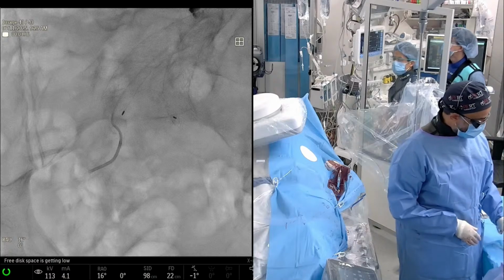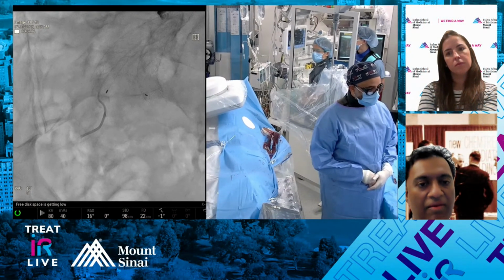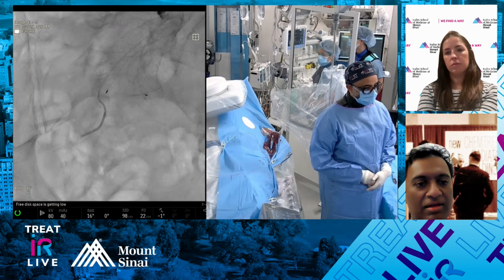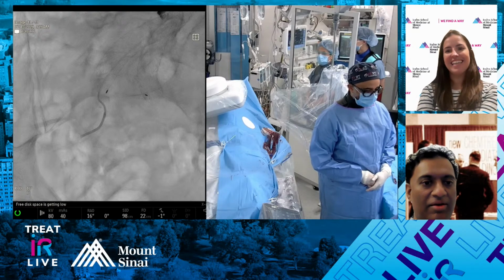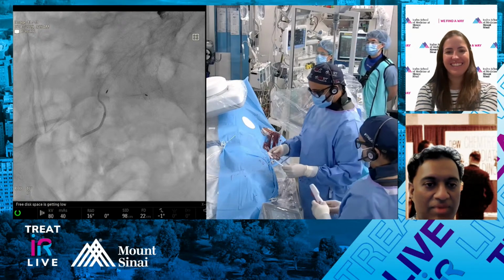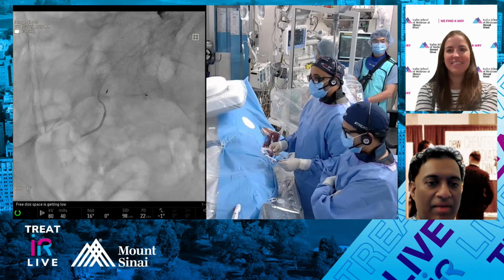Yeah, I think that's a good strategy. The interesting thing about that pod is you have a high radial force coil that comes out first, and then a very soft spaghetti that fills the holes and intersperses. So it's kind of nice to have that. And I think it's wise that you can always put packing coils behind that network.